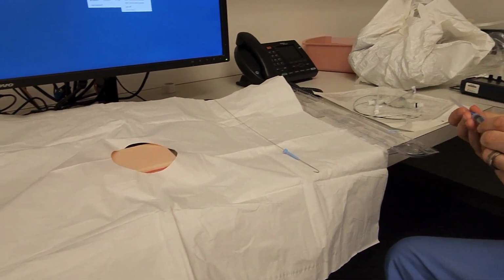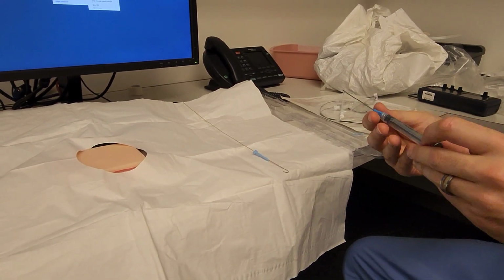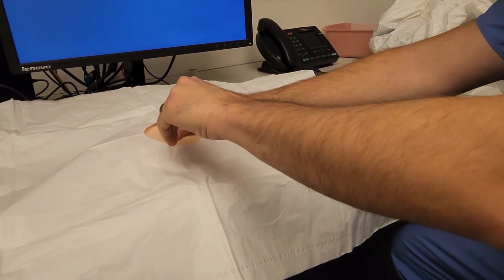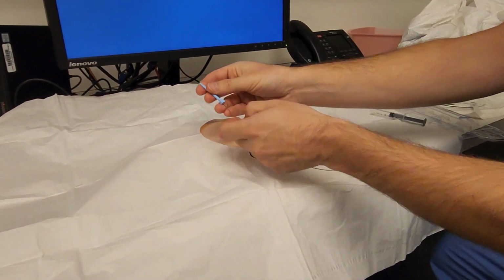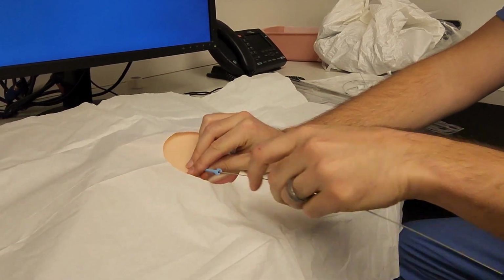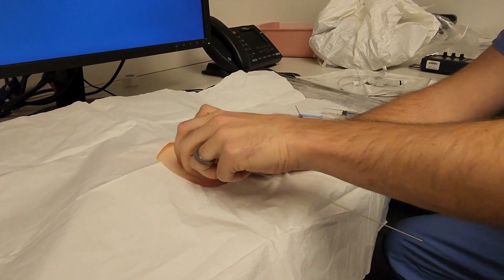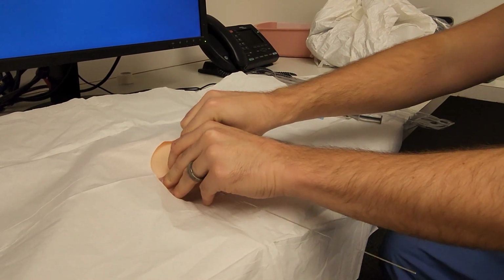Then when you're ready to put the cordis in, get your finder needle under ultrasound guidance, go in at 45 degrees. Once you get flash, stabilize, take off your syringe, and then you're going to insert your wire. Should go freely. Once the wire's in, remove the needle, confirm with ultrasound, and then use the scalpel from the cordis or triple lumen kit to make an incision.